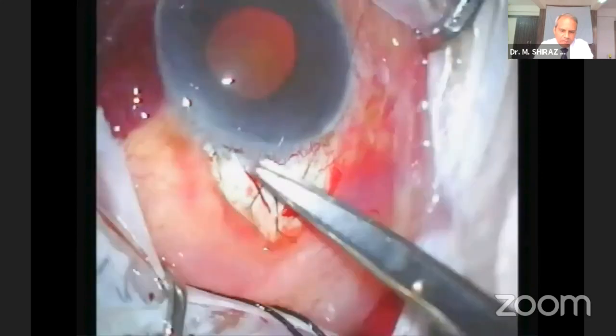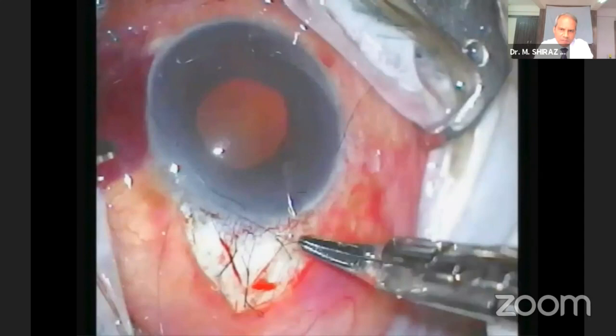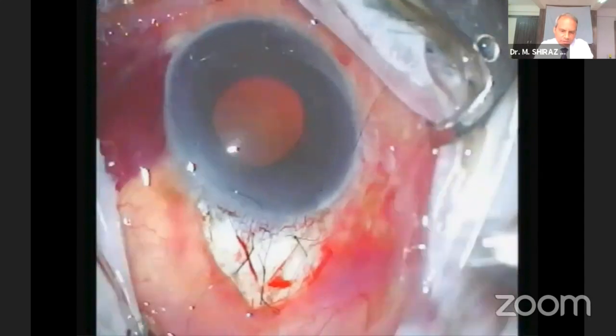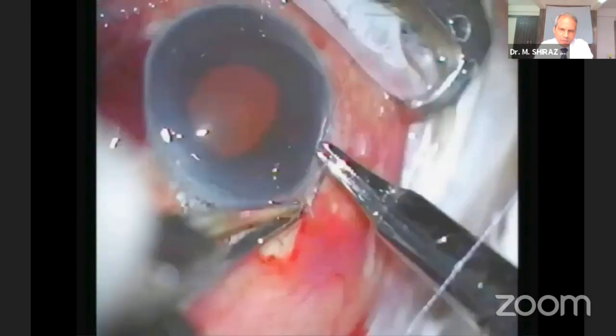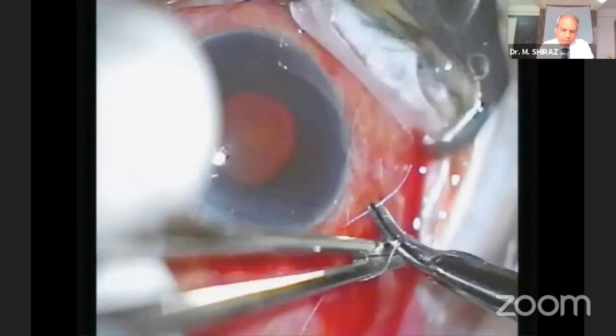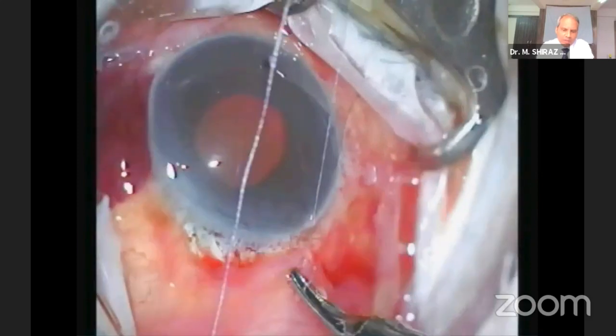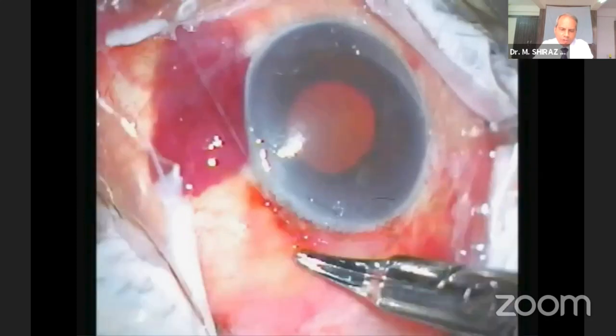The third suture, which is an interrupted one, is being applied to the other side of the scleral flap. The knot is buried in the scleral bed. The bridal suture is removed. For a fornix-based conjunctival flap, two wing sutures are used to attach the conjunctiva to the limbus. It is important to take a firm bite in the episclera close to the cornea.